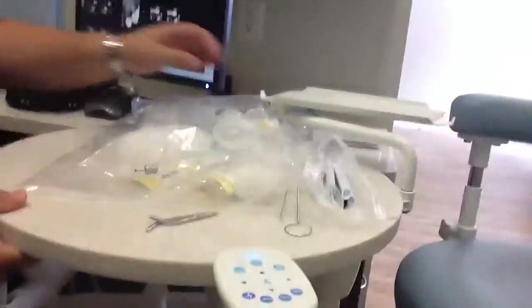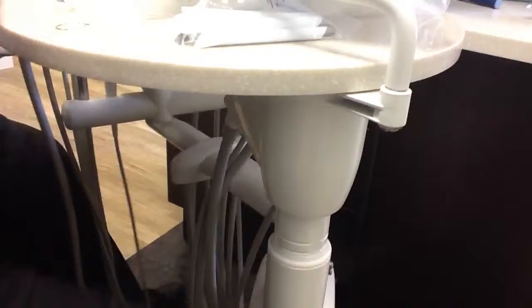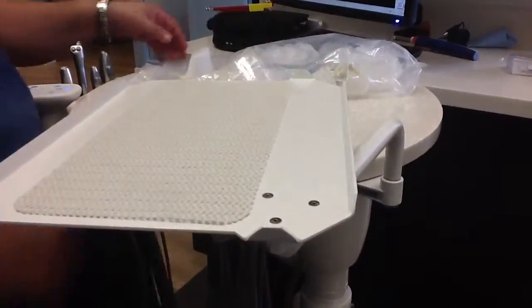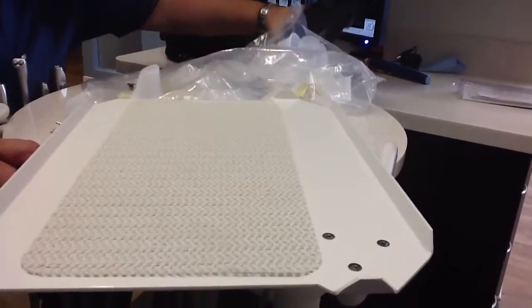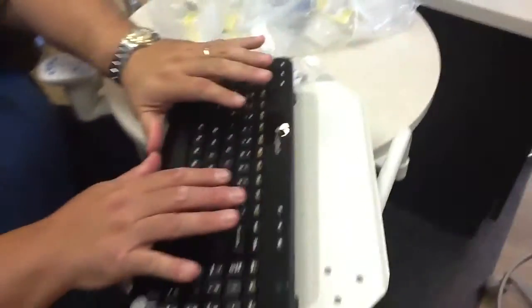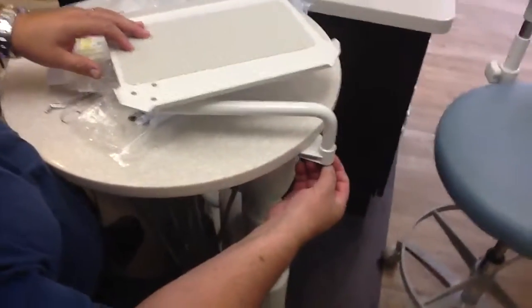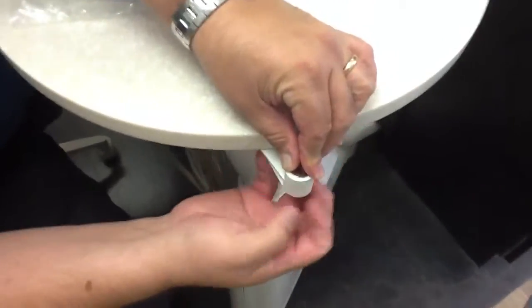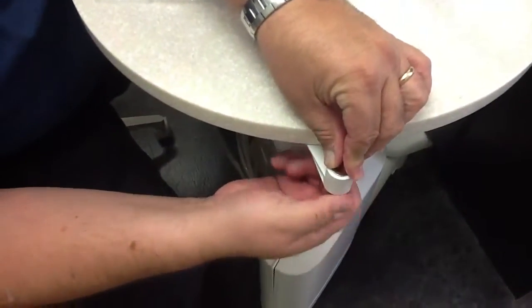Okay, great. Now, one last thing I want to mention, which is real common with these units, is that these guys will loosen up. This tray holder here will loosen up. Now, you'll notice the tray holder is a little bit weird shaped in that this is also designed to put the keyboard on. And when you're putting a lot of weight on this, like resting your arms, then this screw right here will start to give out. See, this just pulls right up. However, underneath here, there is a nut.